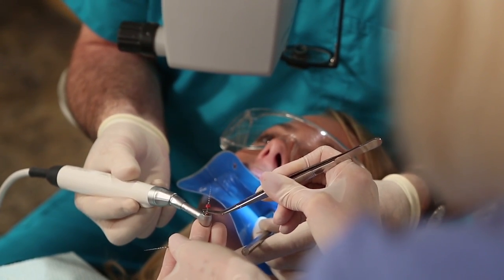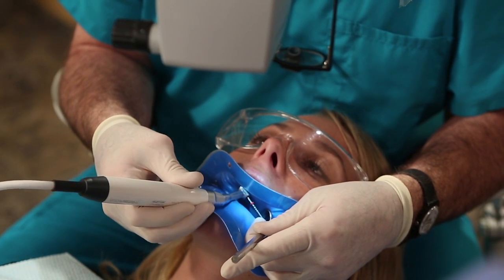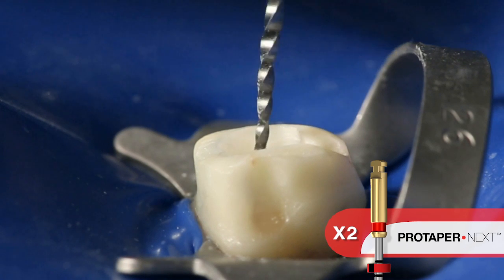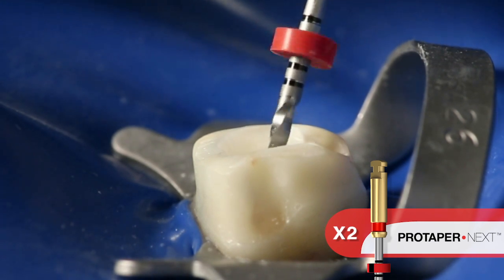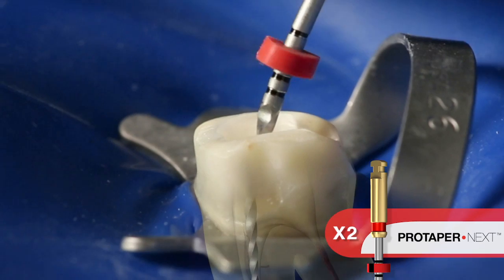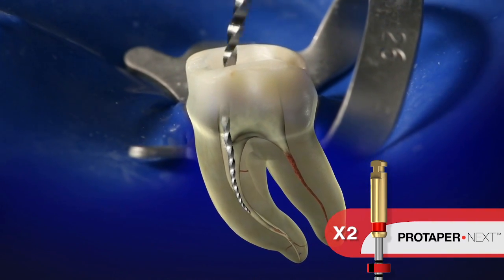Working with a well-trained dental assistant benefits the economy of time. From the lateral view, you can readily see I'm emphasizing brushing. Brushing gives us more centered final preparations, maximizes remaining dentin on the furcation side, and ensures that we're making more contact with dentin as compared to utilizing a pecking or pumping motion.